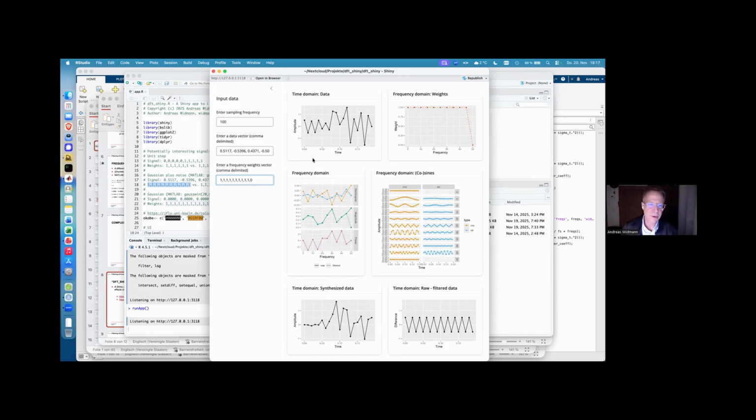So we remove one more frequency component. Okay, still not really optimal, so let's remove even more. Okay, still looks like noise. And okay, even removing until 35 hertz looks like noise. Okay, so if we remove everything from 30 hertz and above, there might be something. So let's do it a little bit more. Okay, a signal is appearing. So we can do even one more.